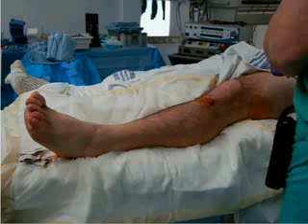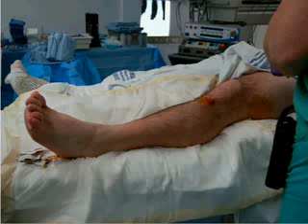The saphenous block may be indicated for surgery on the lower leg when combined with the popliteal block. Together, the two blocks anesthetize the saphenous, popliteal, common, and superficial peroneal nerves. The patient should lie in the supine position on the table with the leg and foot flat.